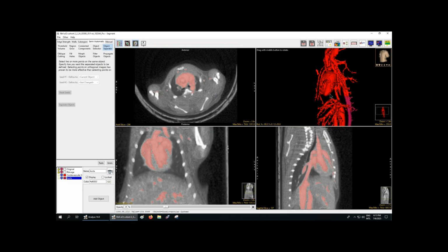So furthermore, now the goal is to segment the aorta out of the top region, including the heart, which can be quite complicated sometimes, considering that if you scroll through the actual slices, you can see that the aorta gets pretty well intertwined with the entire heart, considering it comes out of the heart.